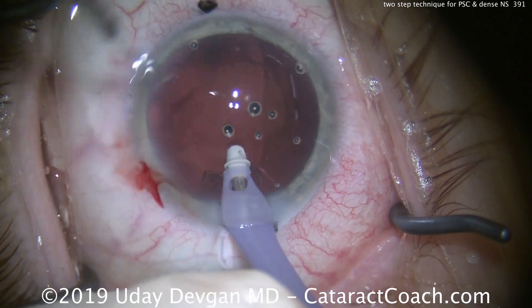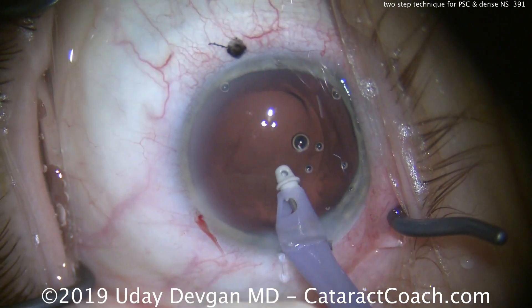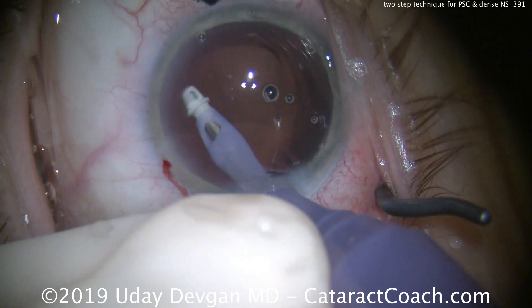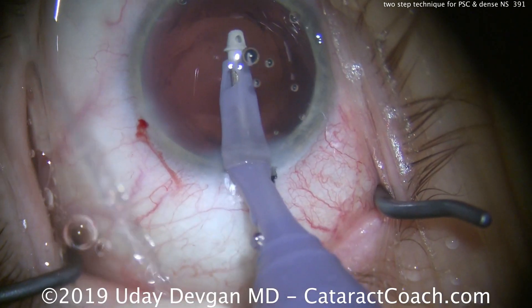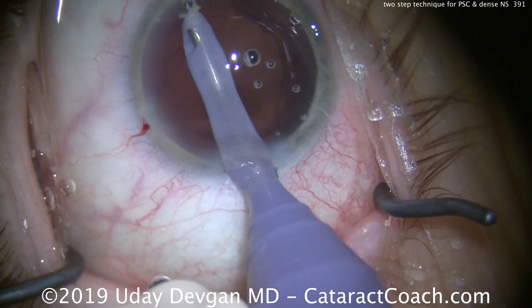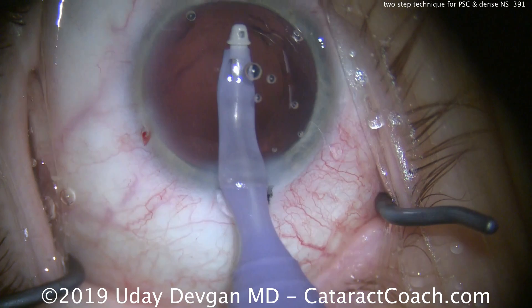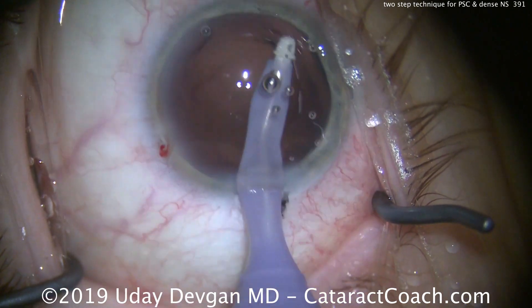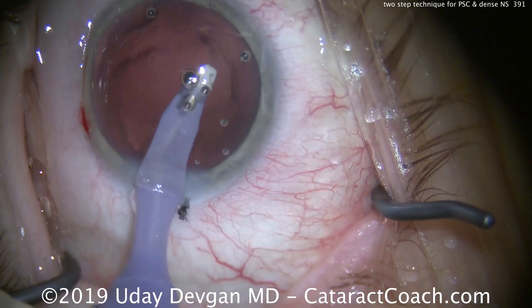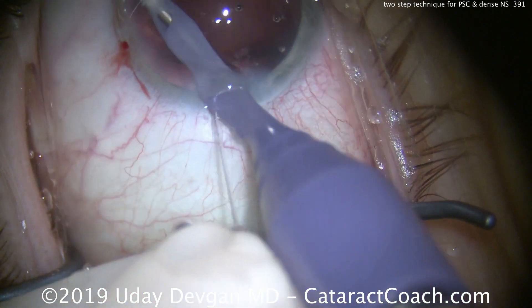We'll polish up the capsular bag to make sure there's no residual lens material remaining. This patient has a mild degree of corneal astigmatism, steep at about 165 degrees, which is why we placed the incision at that position. Here's polishing up the posterior capsule, then going under the anterior capsular rim as well, removing as much residual lens material as possible. We want this capsular bag pristine — we take pride in our work and want this to be as perfect as possible.